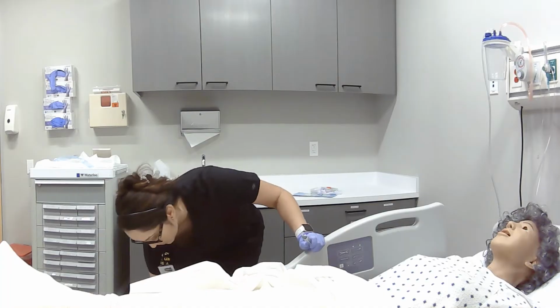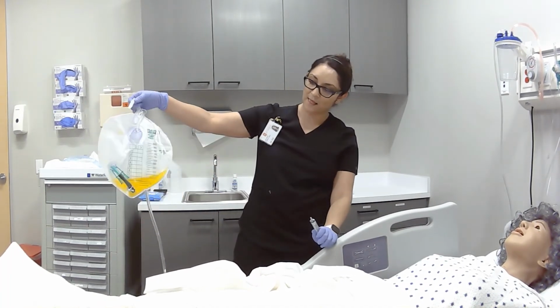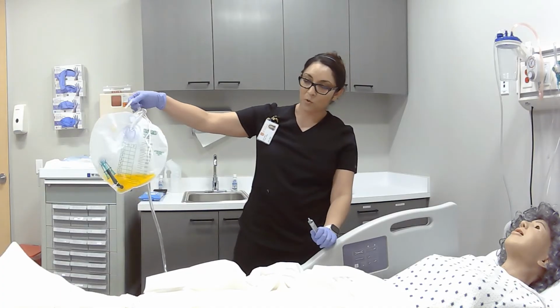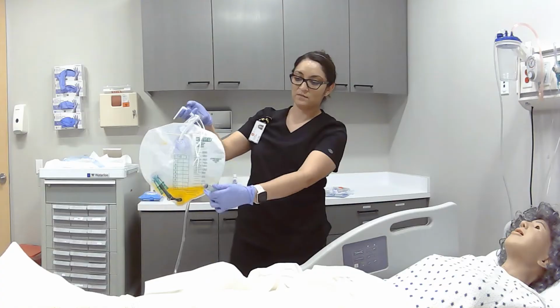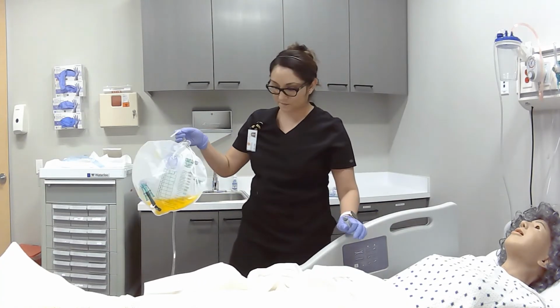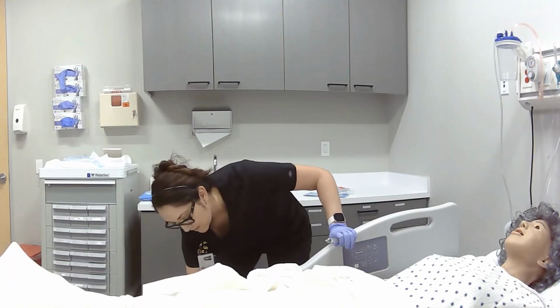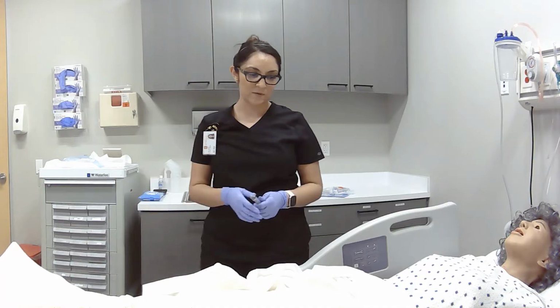So we are looking at the urine here. It's bright yellow. I'm going to pour this out into a measurable cup. We don't want to use the amount here for accuracy. Okay, so I would do that. Empty it, and dispose of it in the toilet, the urine anyway.